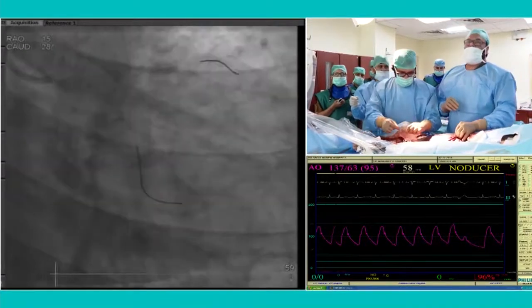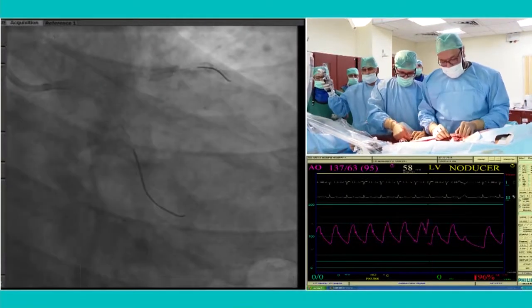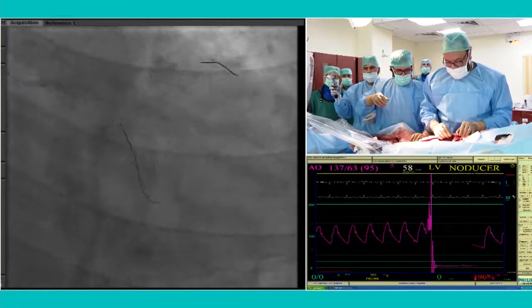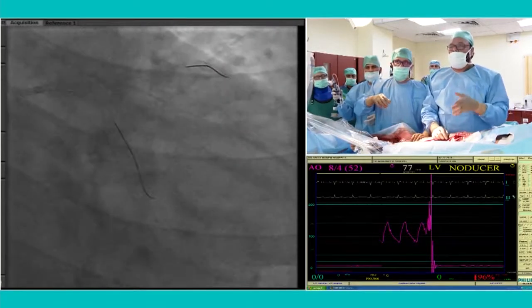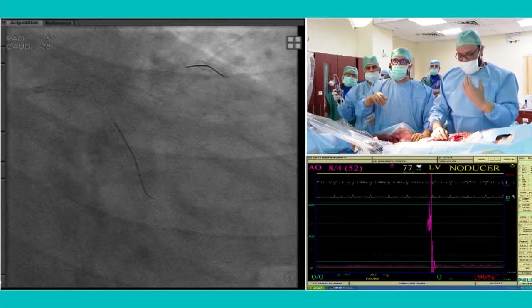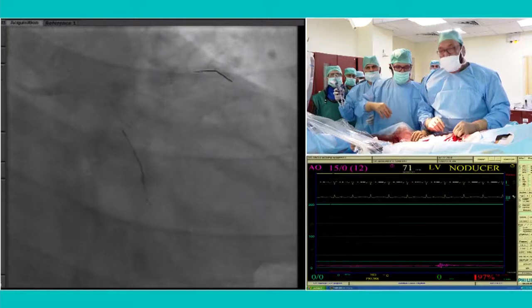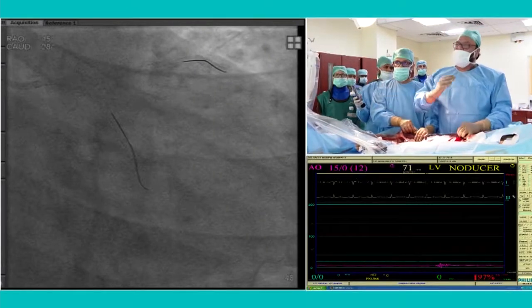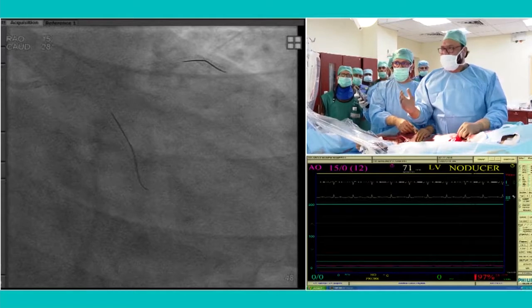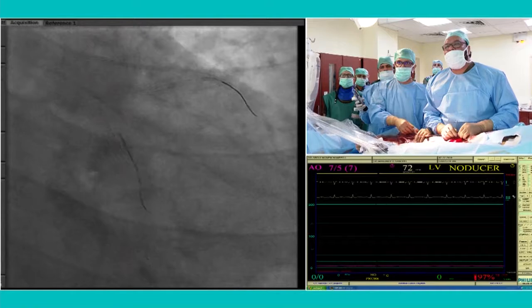Basically, now there is a strategy coming up in T-and-protrusion stenting. People avoid a POT. Yes, you can avoid a POT if you do a kissing balloon well into the proximal area. And plus, I think it's a good strategy not to do the POT if your protrusion has been a bit too much inside the left main. Correct. Will you do an IVUS to understand what is the final lumen area and all?